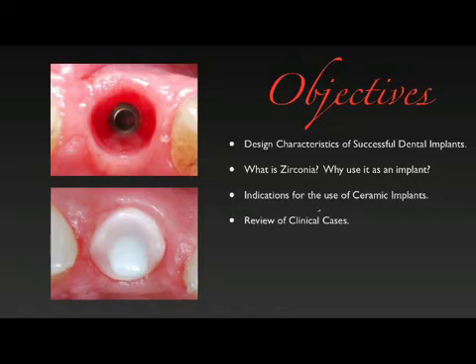This picture is a great picture because prosthetically, I always envision if a patient comes in and has a tooth that looks like this, not an implant, but a tooth, we were all trained that this is something that's non-restorable. But if the patient walks in looking like this with an implant, we have various tools in our toolbox to put a tooth on there, but we're thinking in a way that is not how we were trained with teeth.